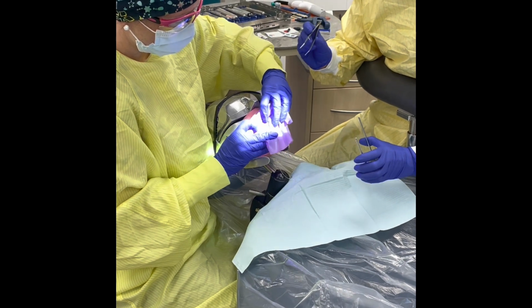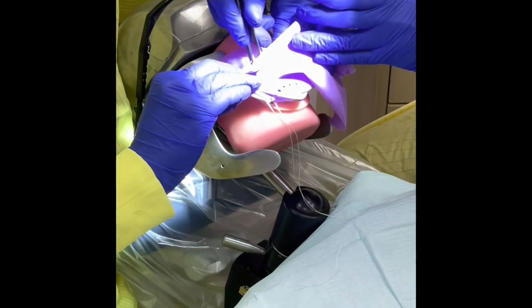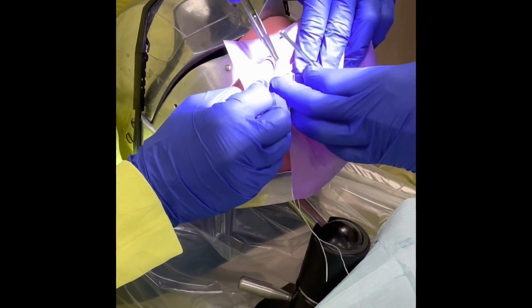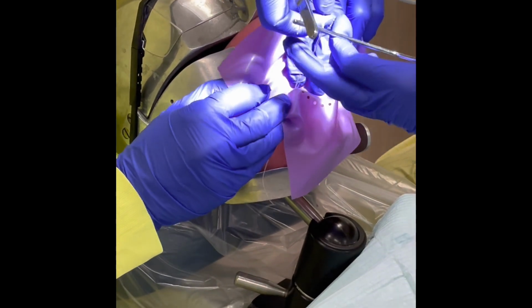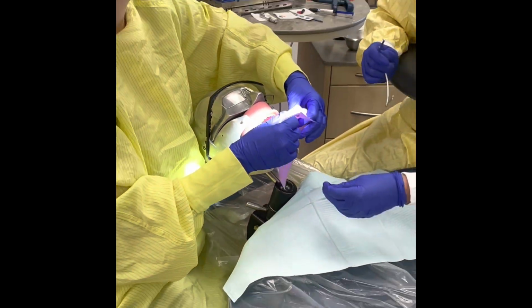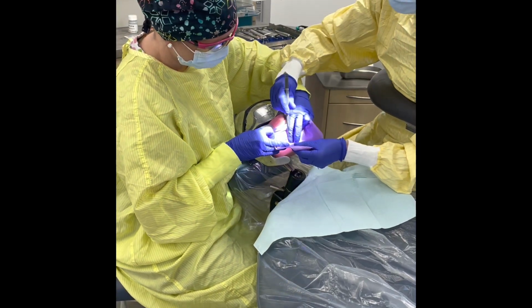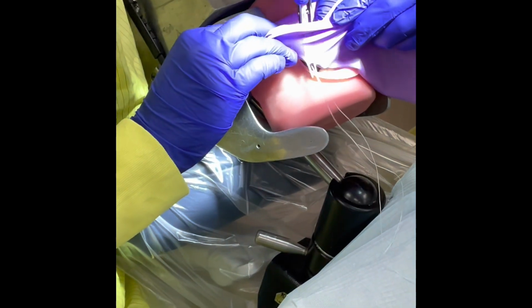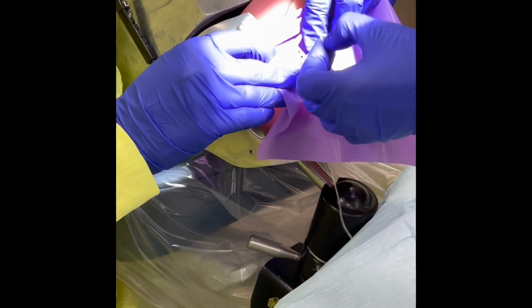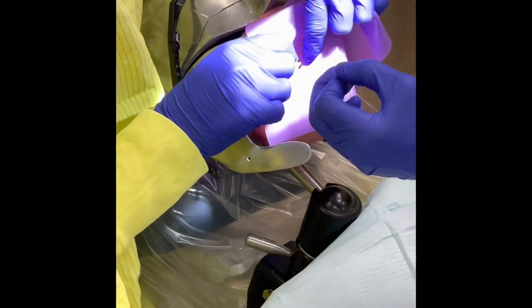I'm going to take my unmarked dental pliers and reach in through so that I can grab the floss. I'm always a little awkward when I do this, but we somehow get it figured out. Make sure that you use your unmarked pliers that are intraoral to do that. And your operator will make sure she's got it in the right orientation when she goes to do that. Let's try that again. That one was smoother. The end result is that we're going to have a dental dam on Martha sometime today. We all need practice. Yep.